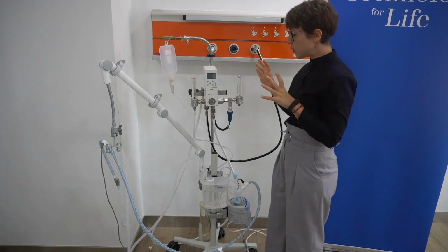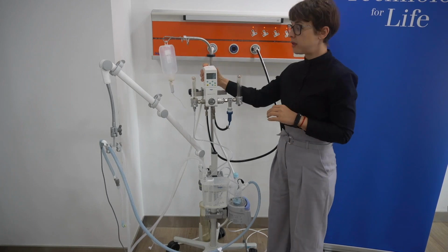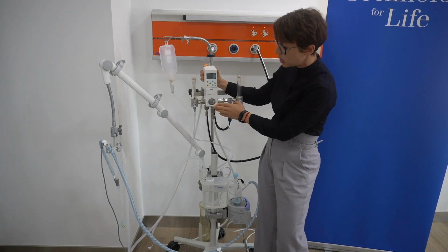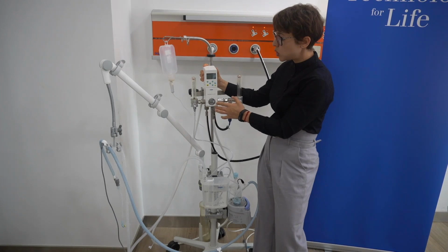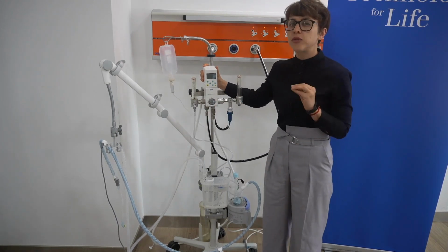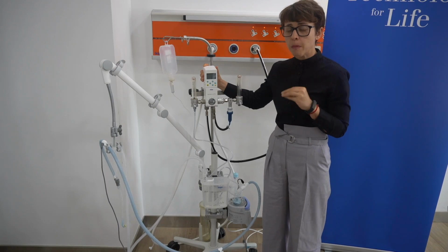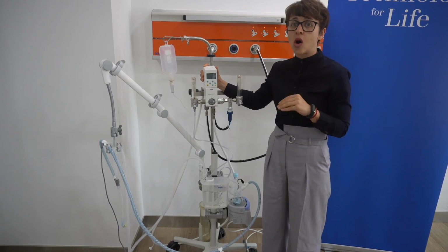So as a part of the system, as a standalone, we have the oxygen concentrator, oxygen mixer. So this can change the oxygen concentration from 21% to 100%. However, as Linda has mentioned, I think we have to be very careful with the delivery of 100% oxygen, because it might have a rather detrimental effect on the babies.